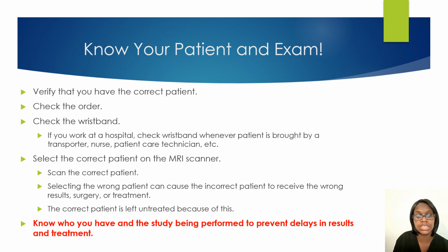Select the correct patient on the MRI scanner. This is very important because you may have the correct patient, but you may select the wrong patient to be scanned. Therefore, the incorrect patient is going to receive the wrong results, wrong surgery, or treatment. So make sure that you have the correct patient and the correct patient selected on the MRI scanner.